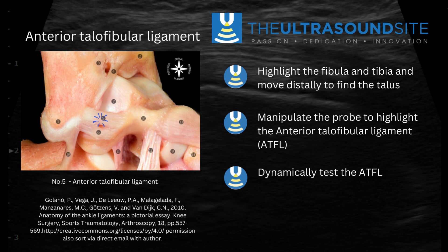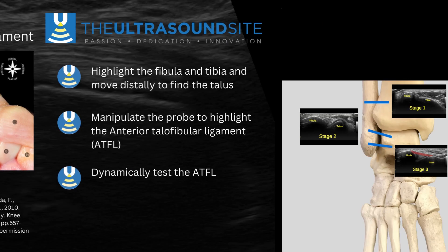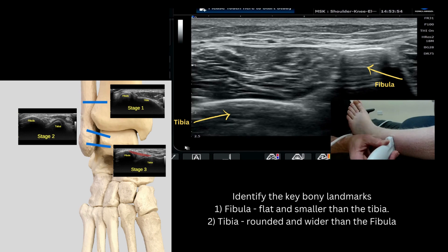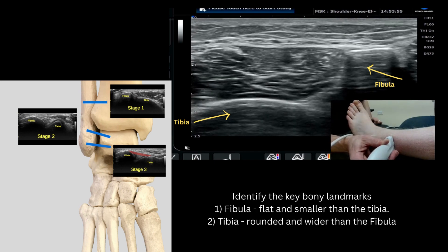We can see here, where the blue marker is, that the orientation of the anterior talofibular ligament is actually very horizontal. It's important to understand that and to consider it when moving your probe and when dynamically assessing.